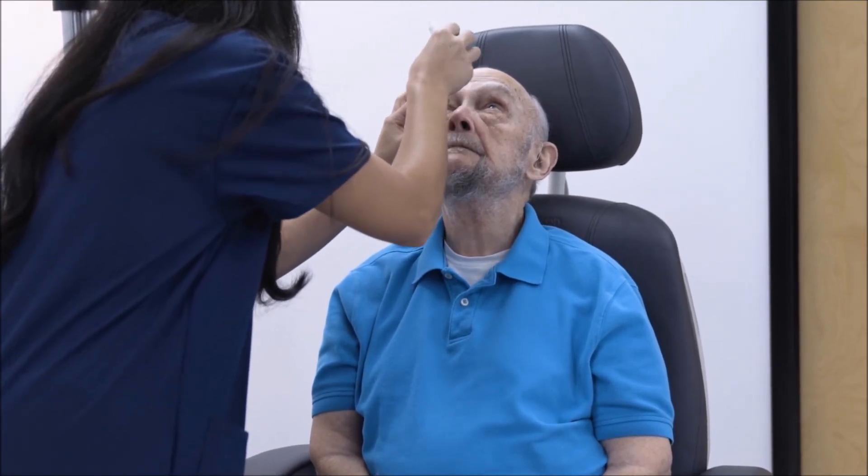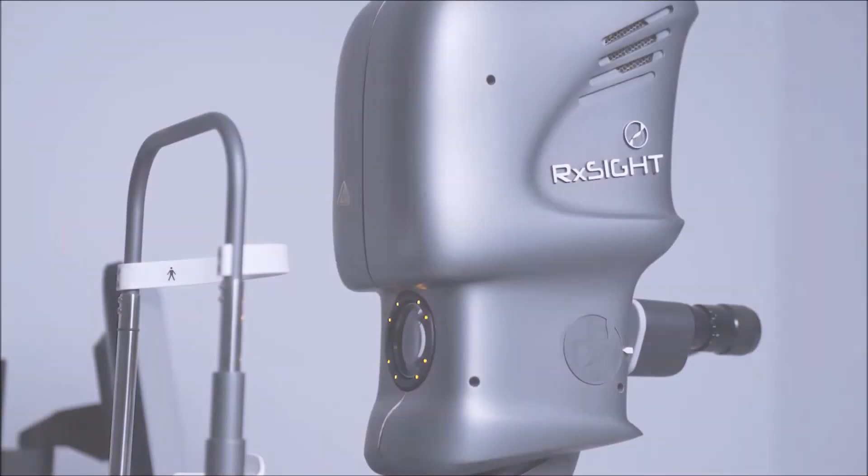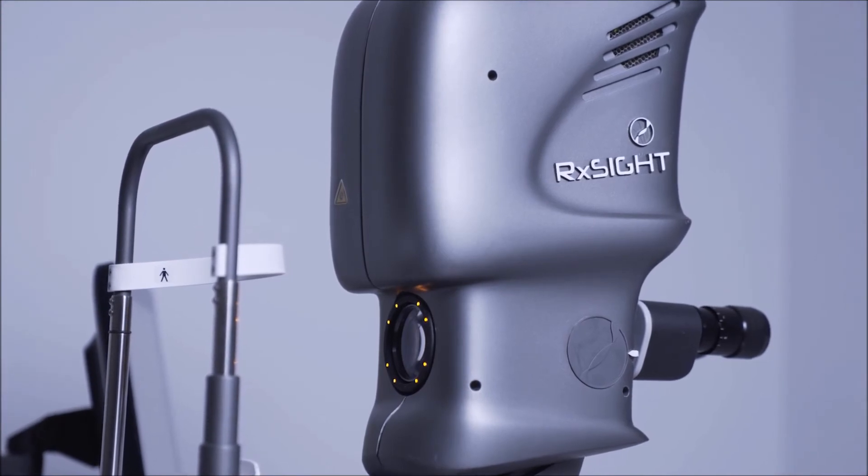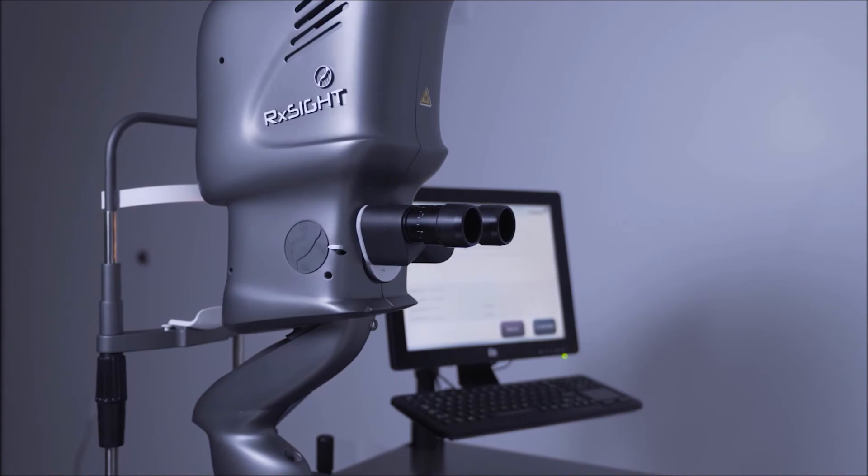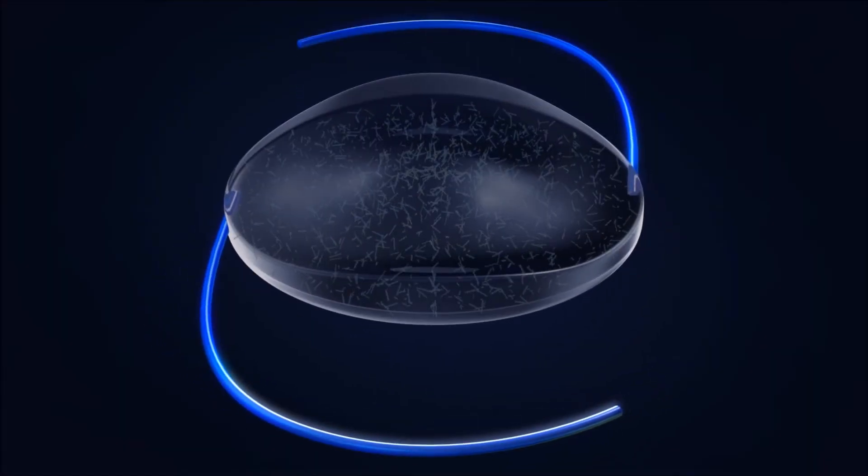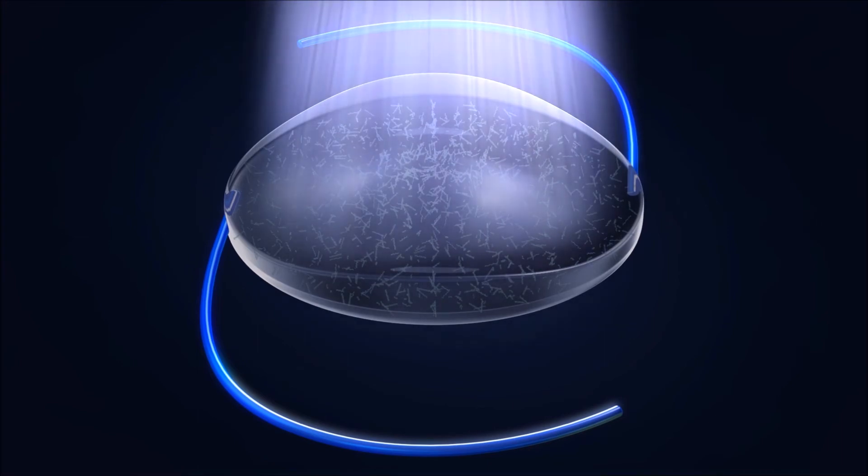Up to 3 adjustments can be performed. The necessity of additional light adjustment treatments is guided by the LDD and based on achievement of desired outcome. Once the best possible vision has been achieved, the patient returns, and UV light is applied to the entire lens to prevent any further changes.